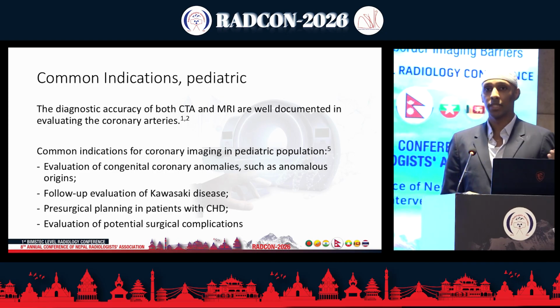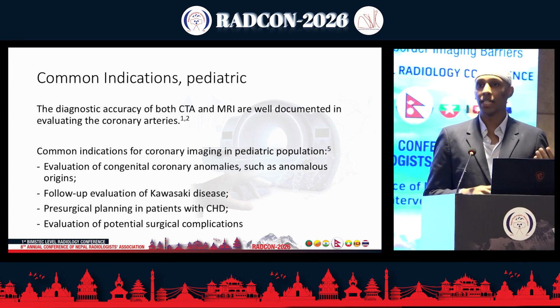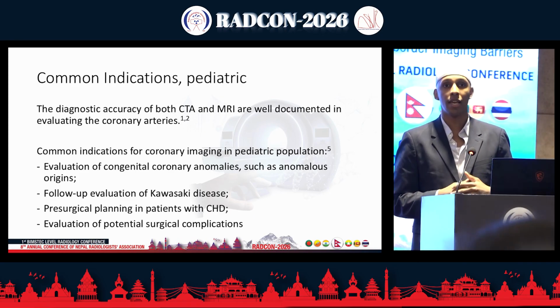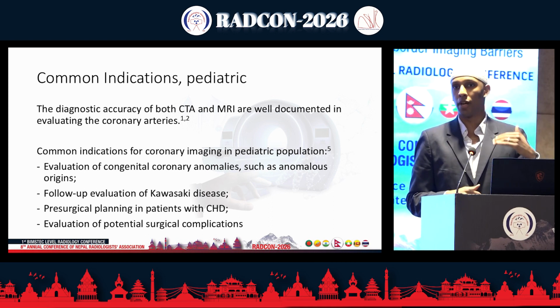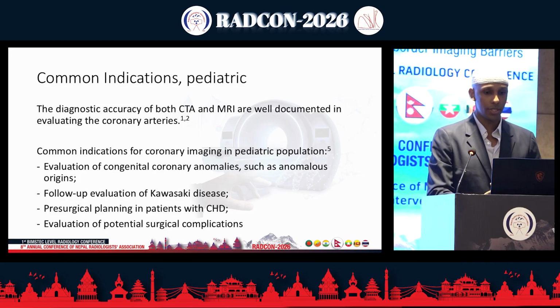This is vastly different than in the adult population, where the single most primary indication for CTA of the coronary arteries is coronary artery disease, stable angina, right? And the next on the list for that is effectively pre-surgical planning for coronary artery bypass graft and post-surgical complications.